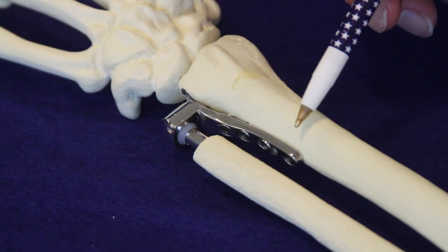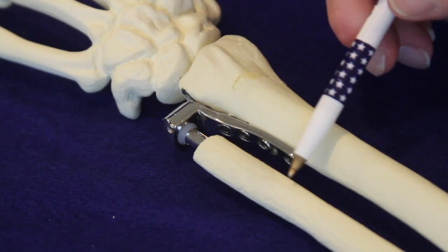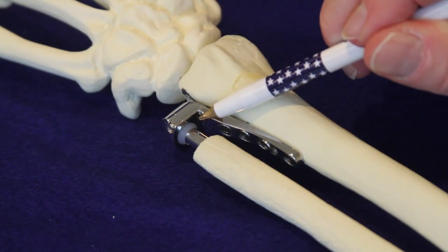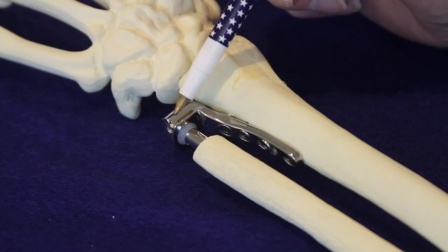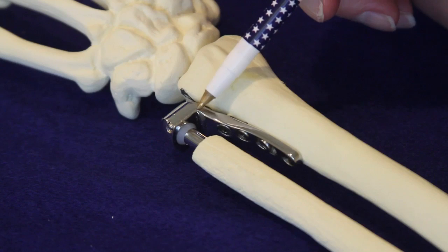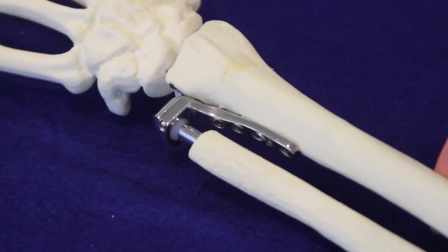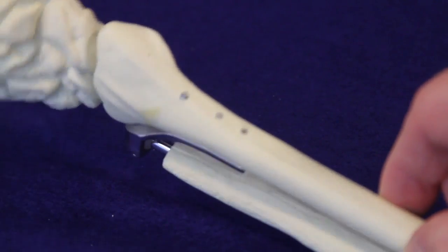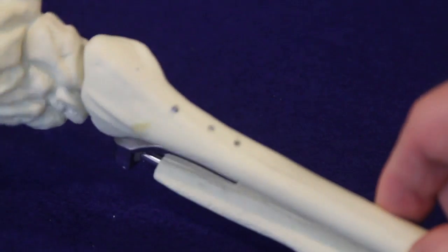Here's another view of the Aptus arthroplasty from the dorsal aspect, showing how it addresses instability and arthritis. The procedure attaches the plate to the radius in the sigmoid notch, removes the ulnar pole, and replaces it with a stem coming down the shaft of the ulna. A polyethylene ball is attached, enclosed by a cap fixed to the radial plate with two screws. This fully constrained implant eliminates instability of the ulna and convergence between the ulna and the radius.